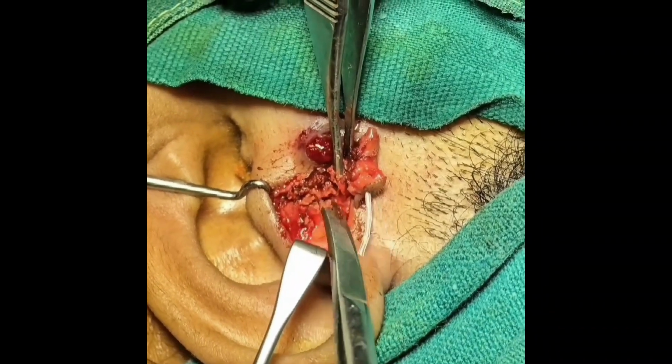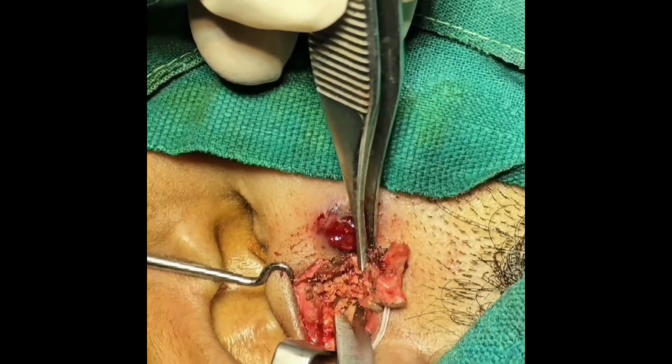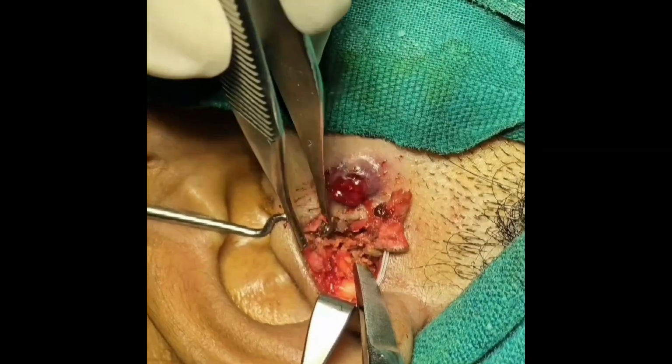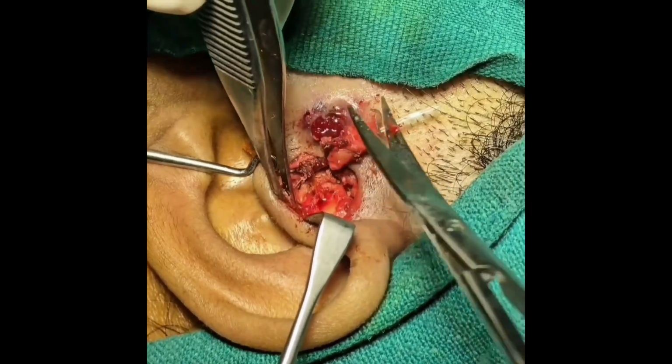So here you can see I'm dissecting anterior to the helix cartilage because the tracts are adherent to that, which is the common finding in all cases of preauricular sinuses. But while doing that, one must be careful not to cut the cartilage of the helix and keep the perichondrium also intact to prevent future perichondritis.